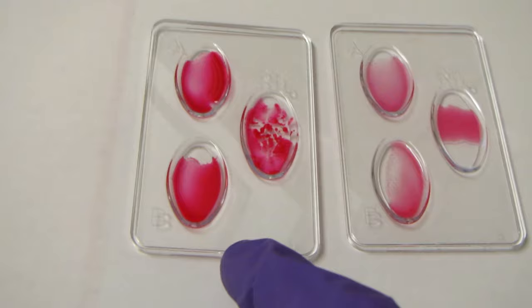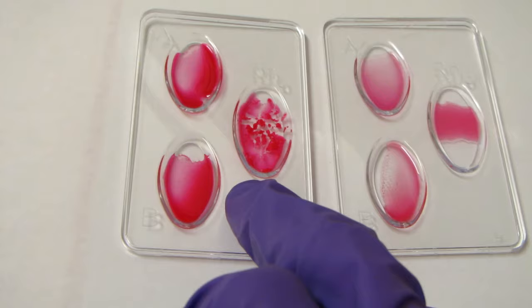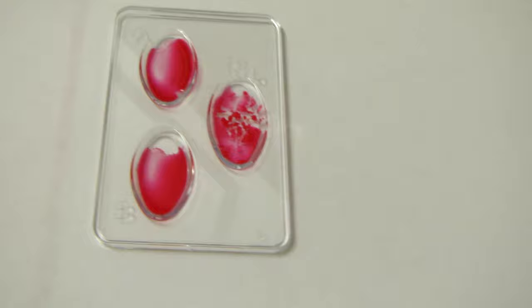Let's compare those two: the one on the left is O positive and the one on the right is O negative. You can see we've got clumping in the RH in the positive one and no clumping in the negative one.